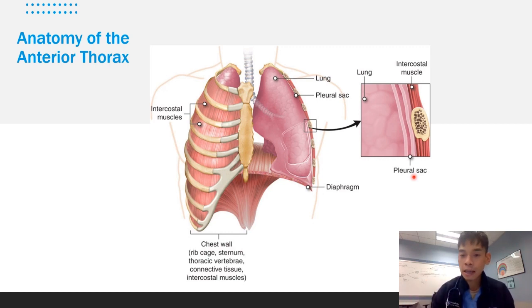The problem is that instead of too much fluid coming into the pleural sac this time, problematically there could be air within the pleural sac. Oh, I apologize. There could be air that comes into that, and then that could restrict it as well. Okay, but again, there is a pleural sac. There is the parietal pleura, and then the visceral pleura, and there should be around 10 cc's of serous fluid in there. So when we talk about the ultrasound, we're talking about probe placement.